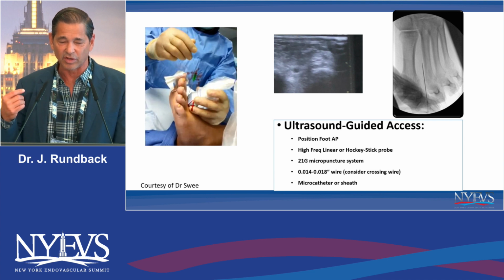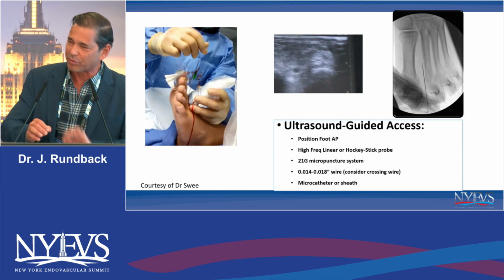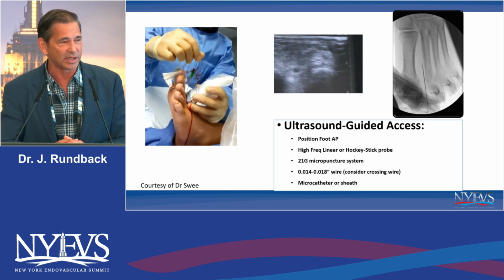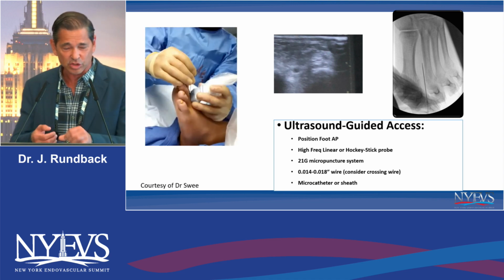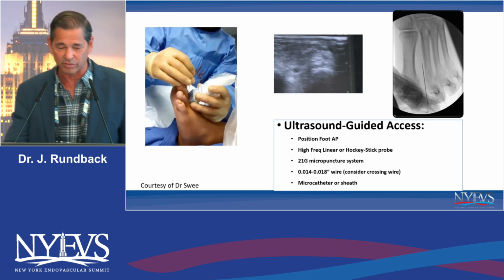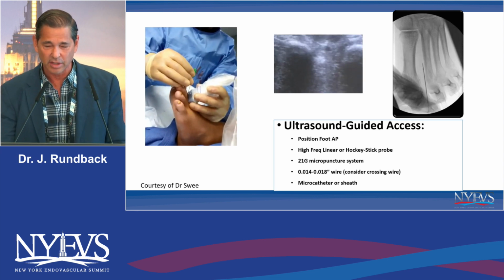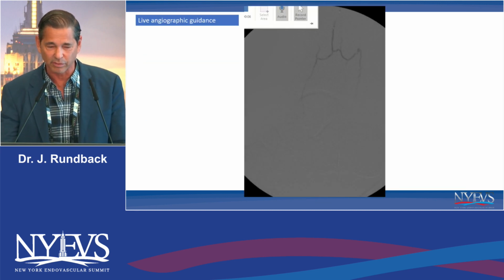Our natural tendency when we pull off the hub of that syringe is that we push the needle in a little bit if the wire doesn't go freely, and you generally have to come back. You can spin it back gradually, rotate your hub up and down, and probe with your wire until it releases. But sometimes it's useful to use the opposite projection than you did for your initial puncture, and I think that's a really useful point.